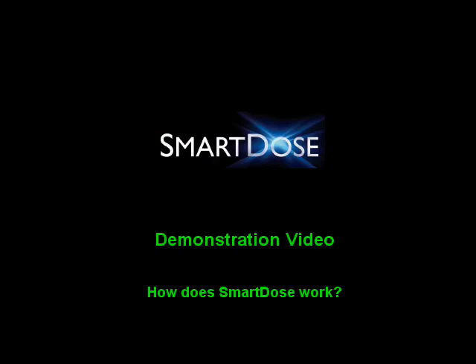Hi, and welcome to this demonstration video showing how SmartDose actually responds to a user's activity level. In this short video, we'll show you how SmartDose automatically adjusts the dose to match rest and exertion, giving more or less oxygen as needed.